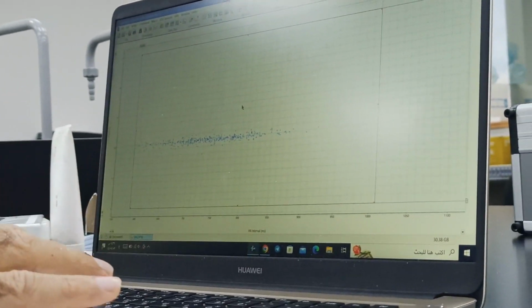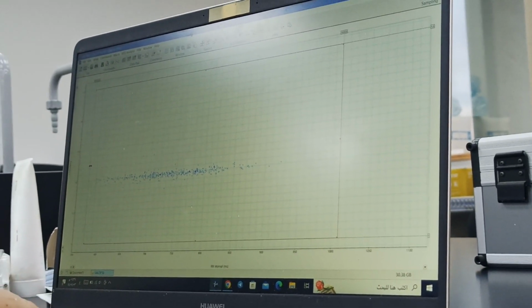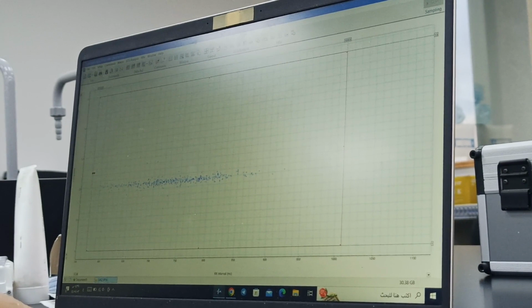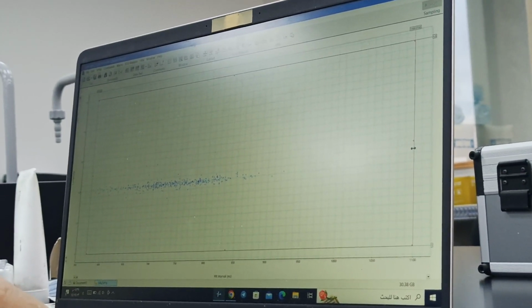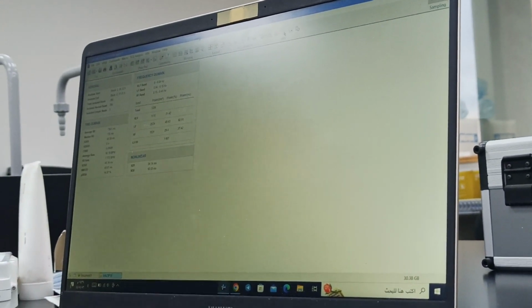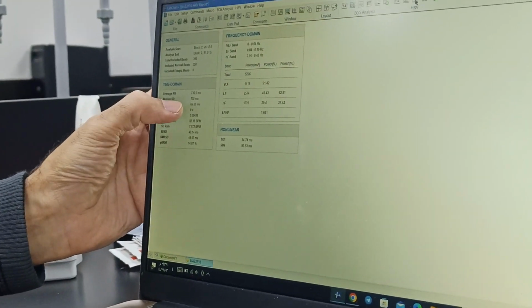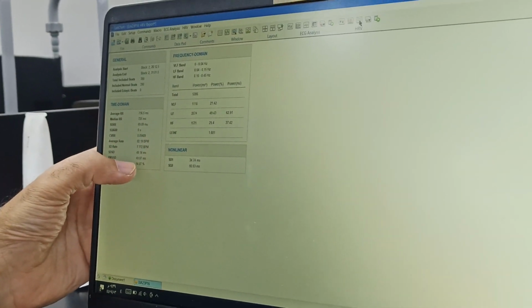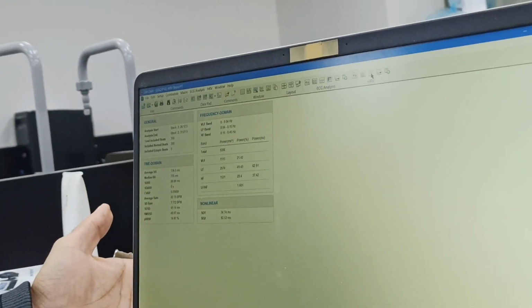So now this is the beat classifier view, and there are not many which are, you can say, out of question. So we include all of them and then see the report. So we have selected 390 beats and 736 average RR with an SDRR of around 70, RMSSD 49 and pNN50 15%. Good. We have got reasonably good data.